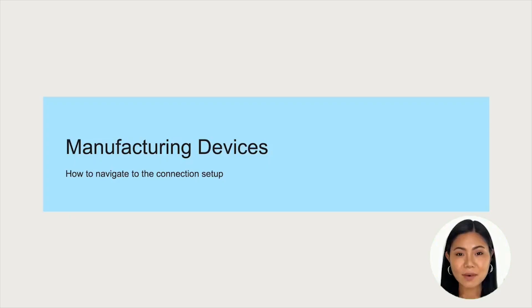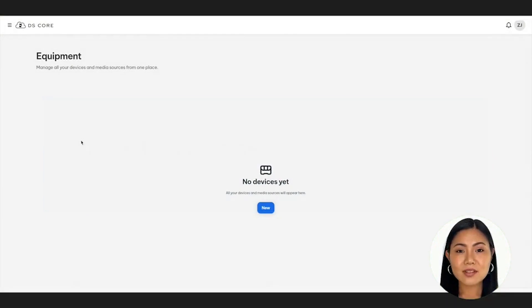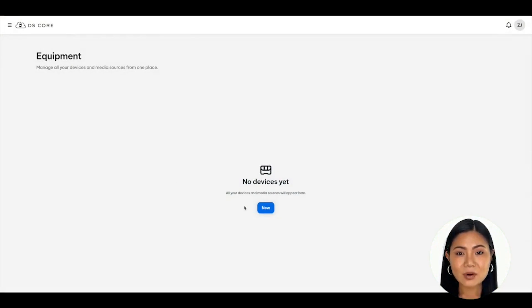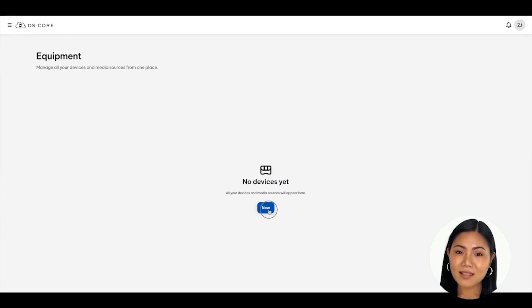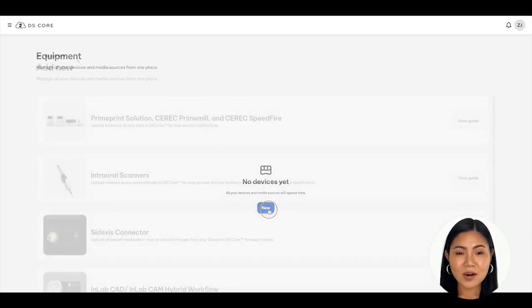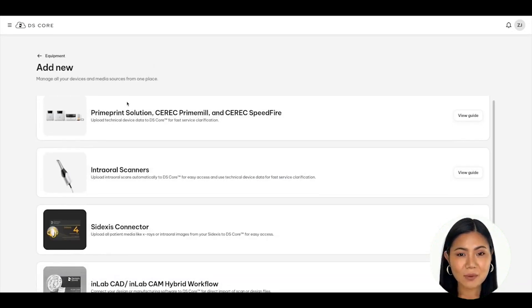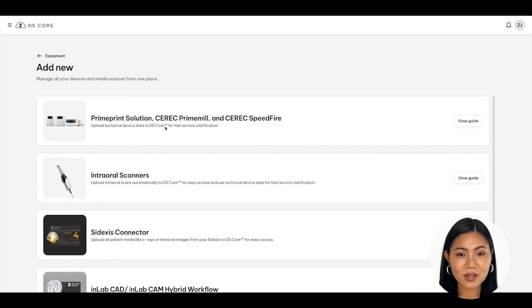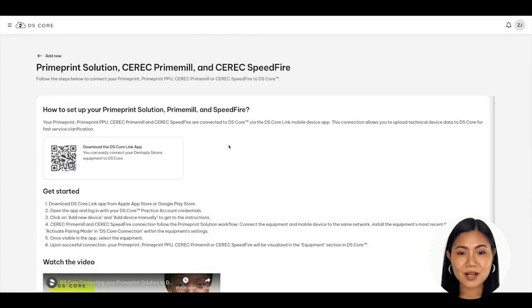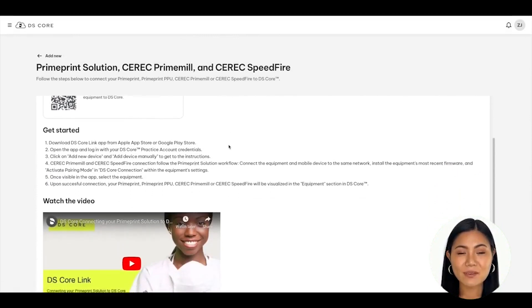If you own a PrimePrint, PrimePrint PPU, CEREC PrimeMill, and/or a CEREC Speedfire, you can directly connect your devices to DSCore via the DSCore link app to start uploading technical device data. By connecting your devices to DSCore, you can benefit from fast service clarification for enhanced technical support. To connect your devices, navigate to your equipment list, click the new blue button, and then click on the white View Guide button located in the PrimePrint Solution, CEREC PrimeMill, and CEREC Speedfire section. A set of instructions will appear on how to start connecting your devices.